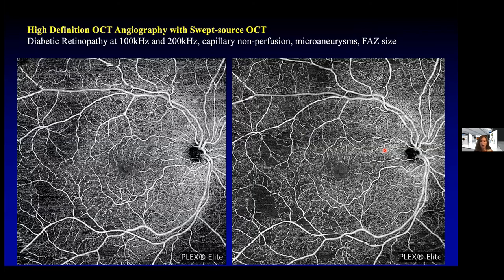Here is an image of high-definition OCT angiography with swept source OCT-A. We can look at images using 100 kilohertz or 200 kilohertz laser source, and we can see on both images that capillary non-perfusion, microaneurysms, and an irregular FAZ size are present. Looking at the image on the right with the 200 kilohertz source, the image is very crisp and clear, and this speed allows very fast imaging.